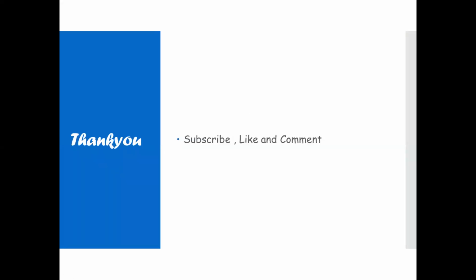So basically that's all. I think there were 4 self-assessment questions. If you got 3 out of 4, very good. If you did not, don't worry, you can watch the video again and still attempt as many times as you like.